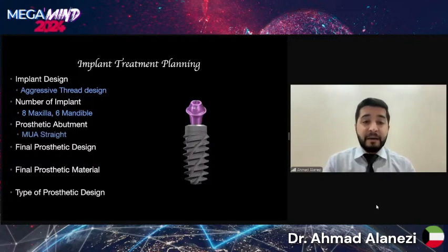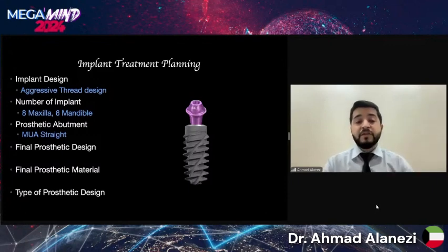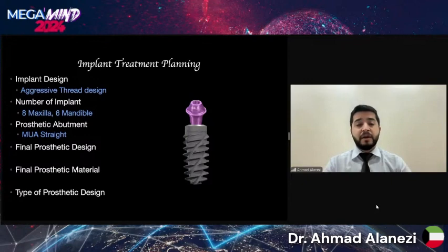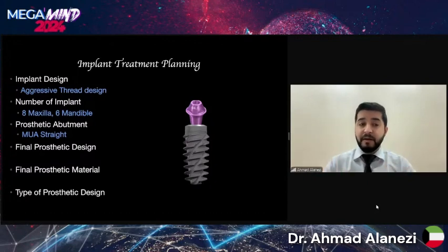For the prosthetic abutment, we are going to have our prosthesis on the multi-unit. We don't want to go direct to the fixture, because we don't want to disturb the peri-implant mucosa in that area. And I'll show you an article by my program director, Dr. Galluci, saying that different types of abutment design will negatively impact the marginal bone loss around it.